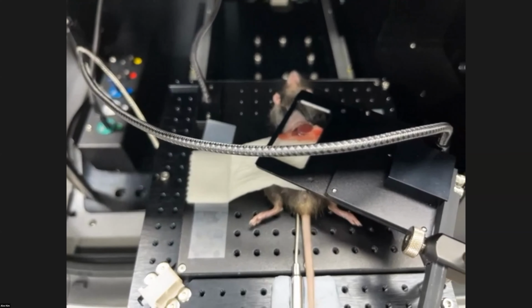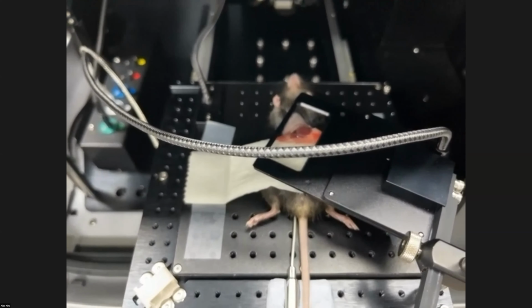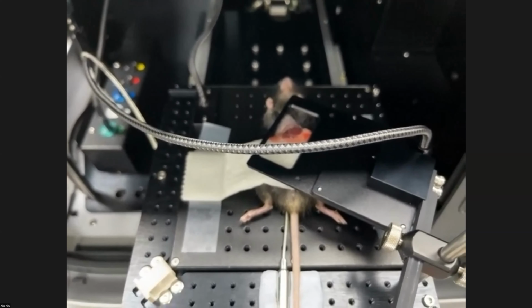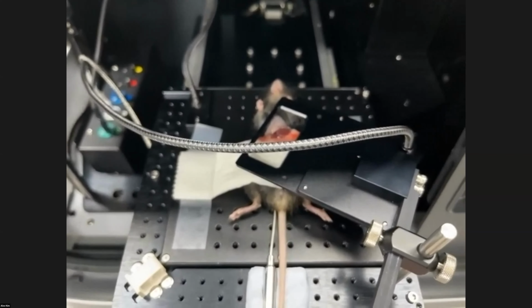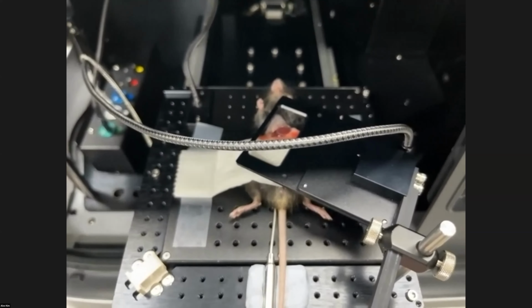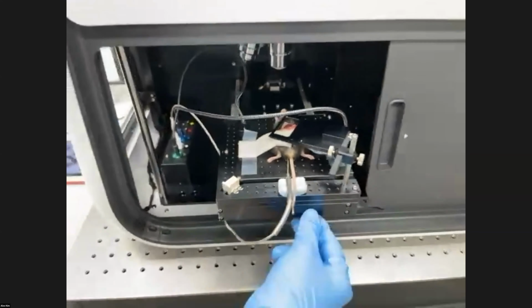As for the surgery procedure of the liver, I will briefly explain about it. After an incision of skin and peritoneal membrane, the liver of the live mouse was mounted on the saline-soaked Kleenex, a disposable towel. And to start the imaging, I will slide the animal stage inside the imaging room.